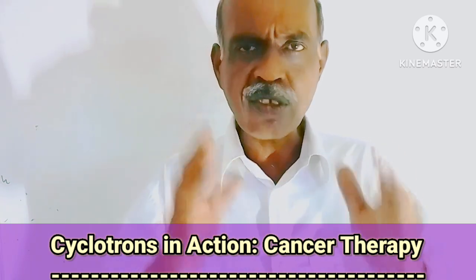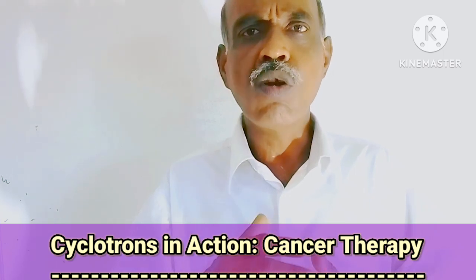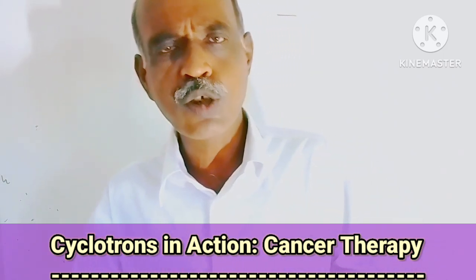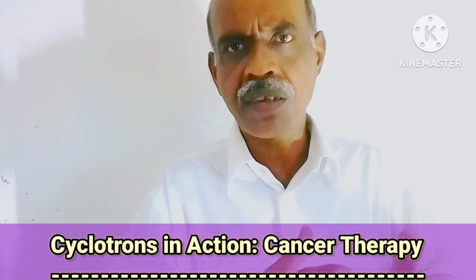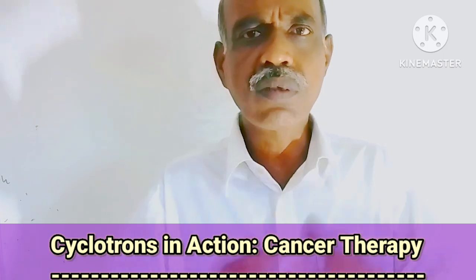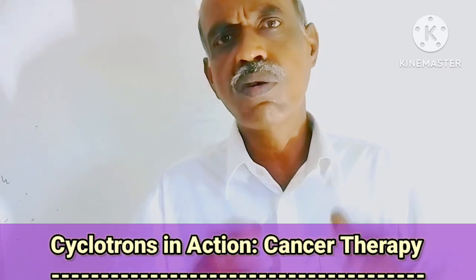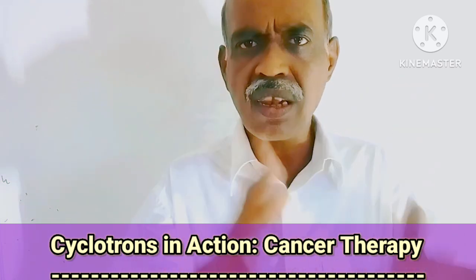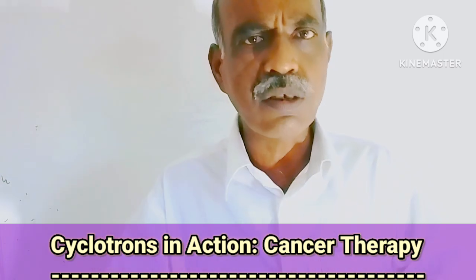The first point is that it is highly controlled. You can target any cancerous part of the body, especially parts like the spinal cord, eyes, and brain, where the structures are somewhat complicated. If cancers occur in those places, proton therapy is the best choice, because protons can be controlled precisely.